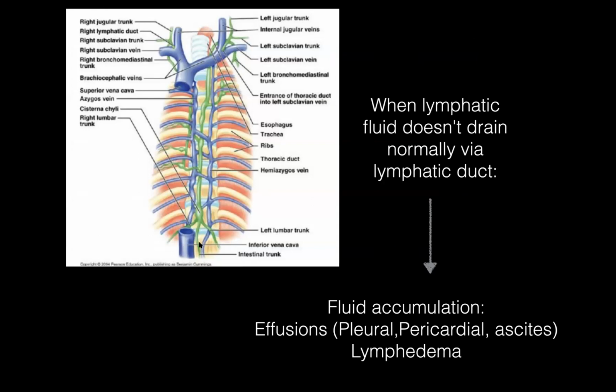So here's an example showing, in green, these lymphatic channels. And this is a subclavian vein coming off and then it comes back to the heart through the brachiocephalic vein. And normally this duct drops right into there. So maybe I'll end with that case.